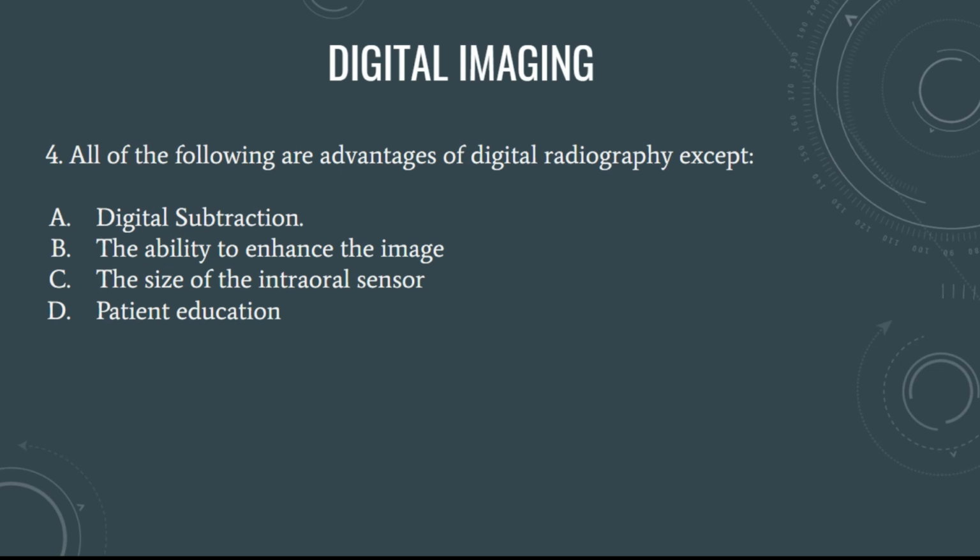And last, all of the following are advantages of digital radiography except A, digital subtraction, B, the ability to enhance the image, C, the size of the sensor, or D, patient education. The correct answer is C, the size of the intraoral sensor.